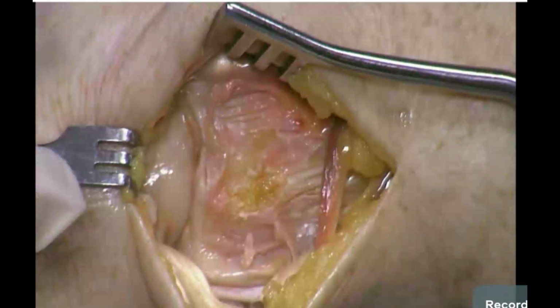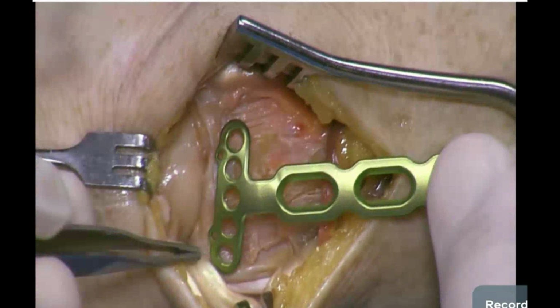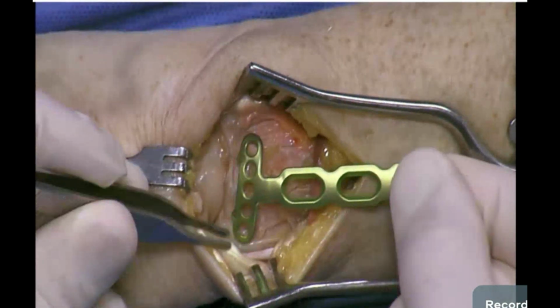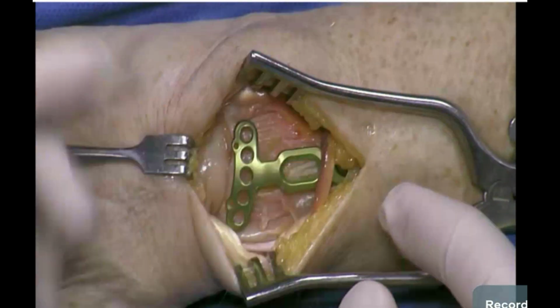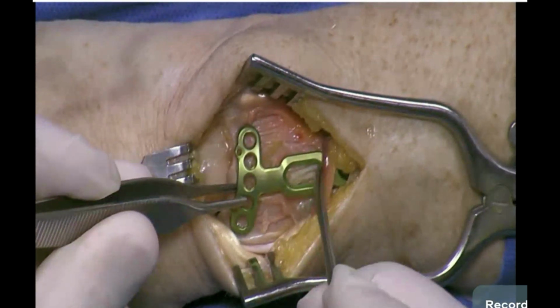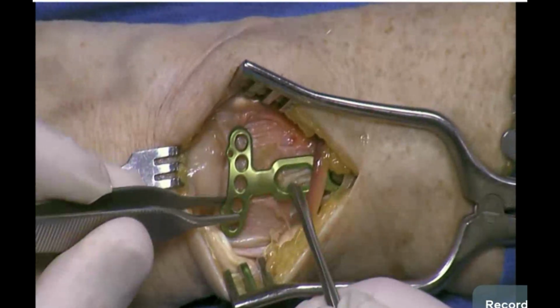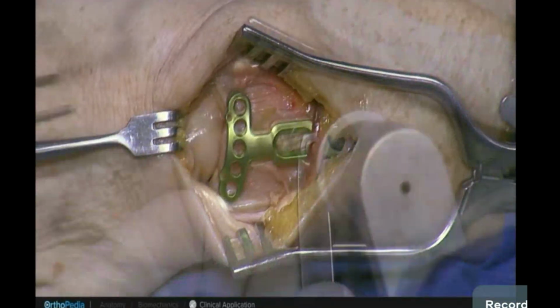And now we're ready for some type of plate. Here's a narrow plate. We have a fairly small specimen, so that looks like the best fit. So this plate slid back under the pouch, and then with a drill guide, one of the oblong drill holes will be selected first, depending on our degree of comminution, either here or even back here onto the shaft.